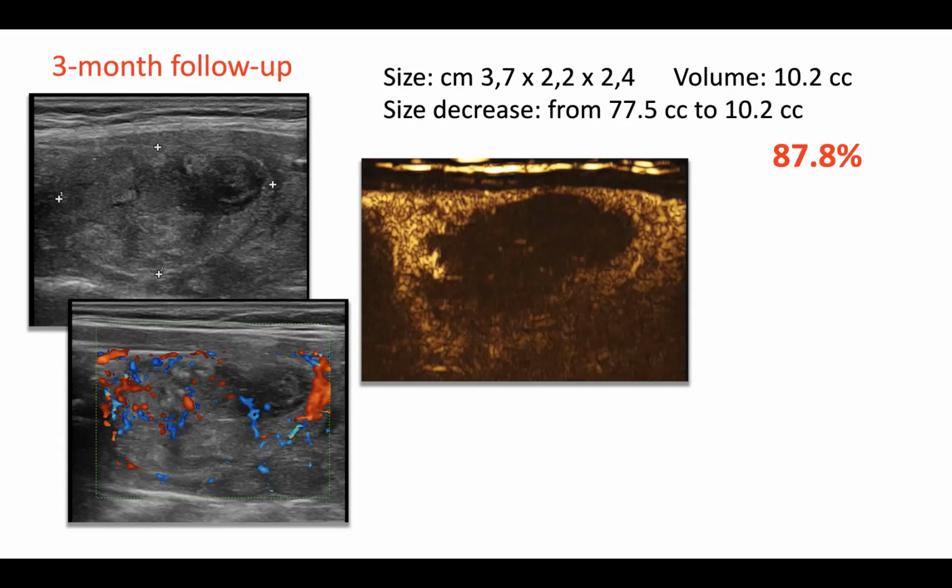This is really an enthusiastic result, demonstrating the validity of the thermal ablation of thyroid benign nodules and the excellent activity of this new machine, which allows us to reach in a short time precisely all the areas, always visualizing very well the position of the electrode during the procedure.